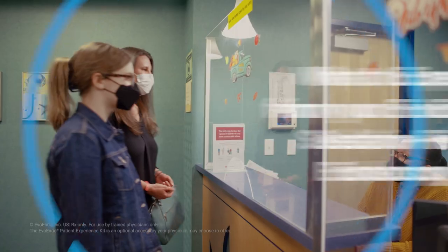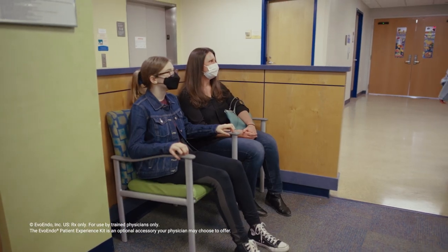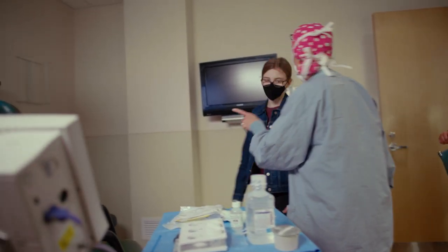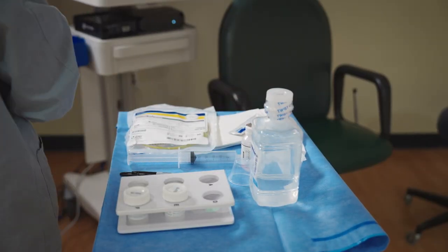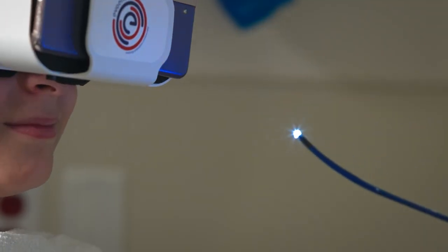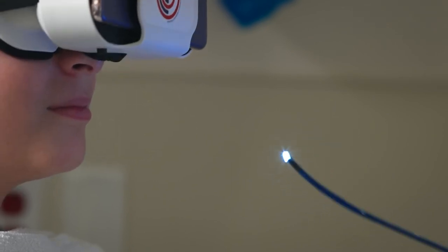When you arrive for your EvoEndo Sedation-Free Transnasal Endoscopy, also known as a TNE, you'll check in and go to a room to meet with your clinical team. Once in the procedure room, you will see equipment set up that your doctor needs to perform the procedure. You might see the EvoEndoscope, which is a long, flexible tube with a camera on the end of it. The tip of the EvoEndoscope is a little wider than a spaghetti noodle, but much smaller than your pinky finger.